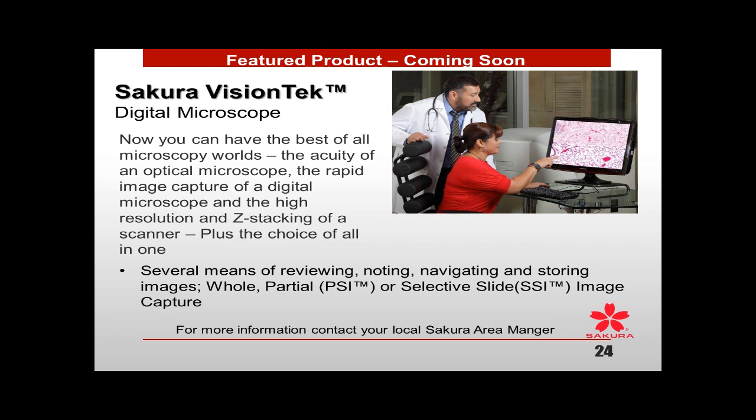We're going to have to make sure they get some sort of correlation or concordance between what they see on the glass and what they see on the digital. Their quality assurance would be no different than what we're setting up now for any of our quantitative algorithms that we're using for ER, PR.